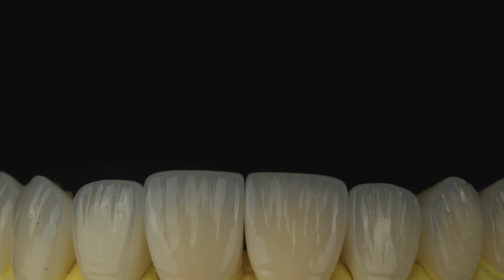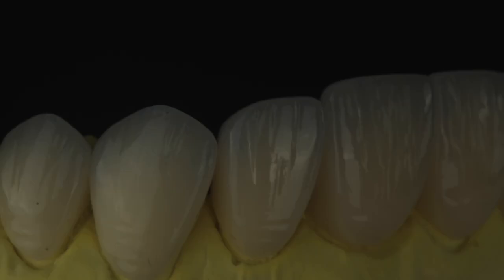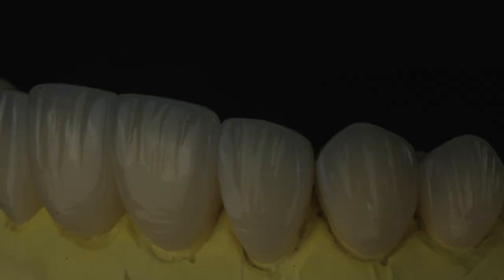Actually, ang gusto niya, it's BL3. So we delivered BL3, but there are a few shades that would counter the opacity of the zirconia. So there are a lot of techniques that you have to incorporate to be able to pull off natural-looking yet super white, timeless, very durable and stable, beautiful ceramics.